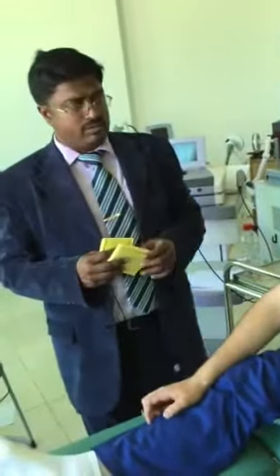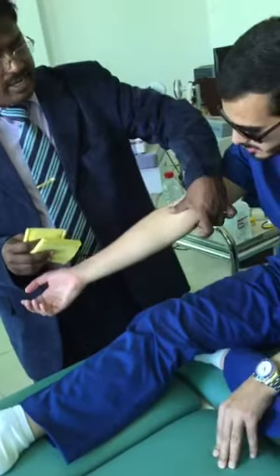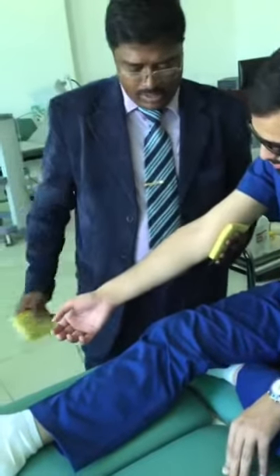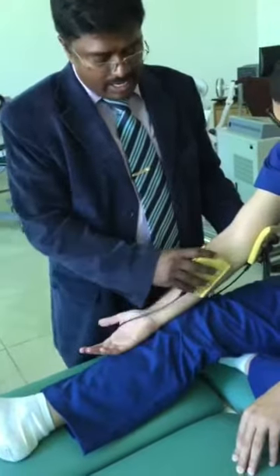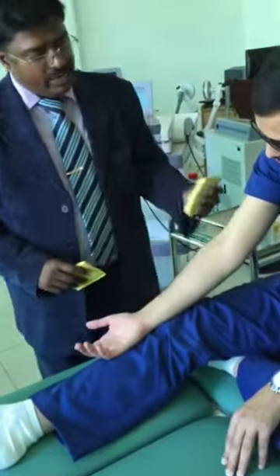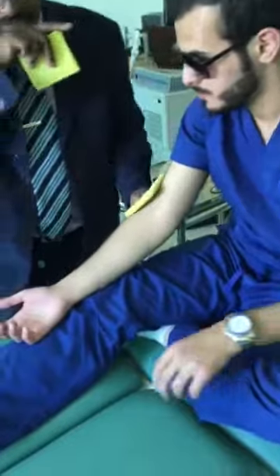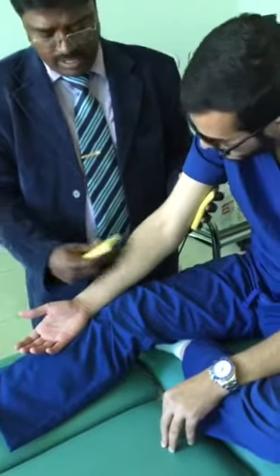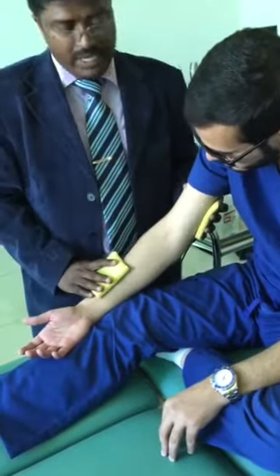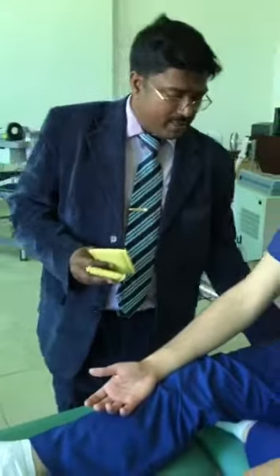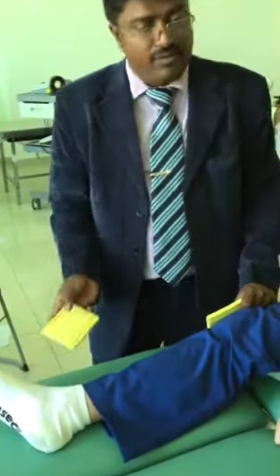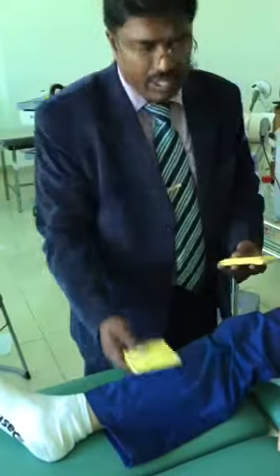For the ulnar nerve, the ulnar nerve is superficial at this point — the medial epicondyle area. You keep one electrode on the ulnar nerve and one on the ulnar aspect of the hand. For the median nerve, you keep one electrode on the medial aspect of the arm and one on the lateral aspect of the forearm. If the sciatic nerve is painful, keep one on the buttock and one on the posterior aspect of the leg. For the common peroneal nerve, keep it on the fibula head and the dorsal aspect of the foot. For the tibial nerve, keep it on the popliteal fossa and the posterior aspect of the calf.